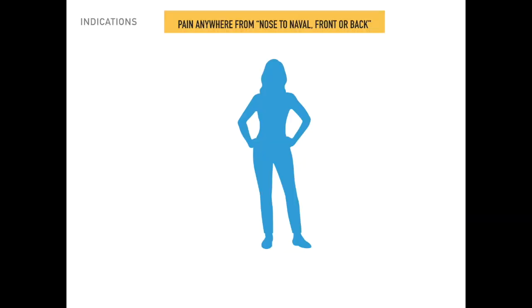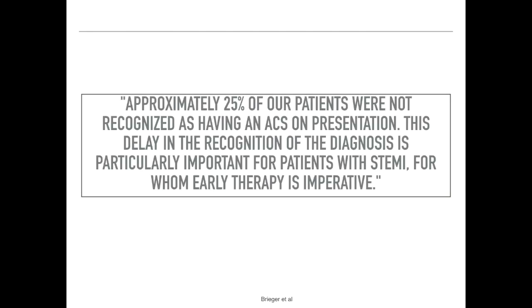So what are the indications for obtaining a 12 lead? I like to say it's a patient that's having pain anywhere from the nose to the navel, front or back. We do know that about 25% of patients were not recognized as having ACS on presentation.